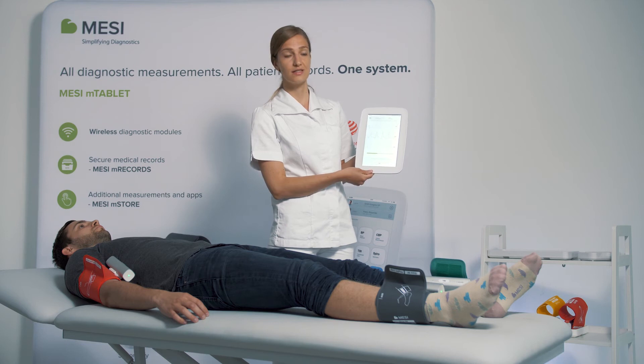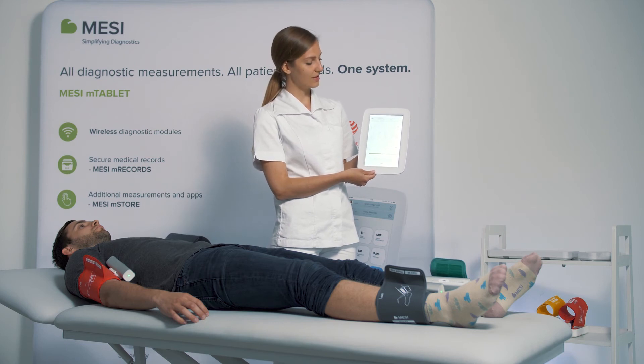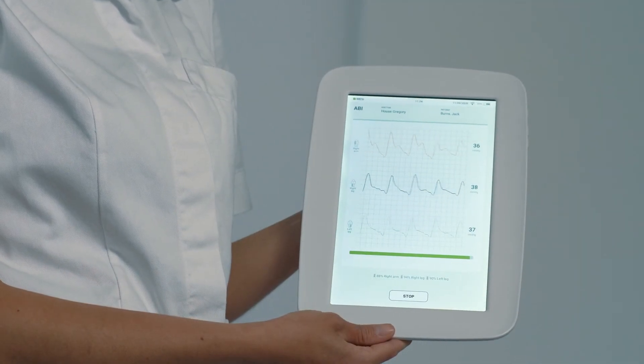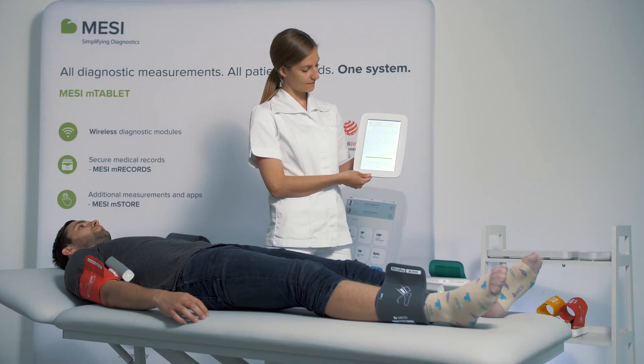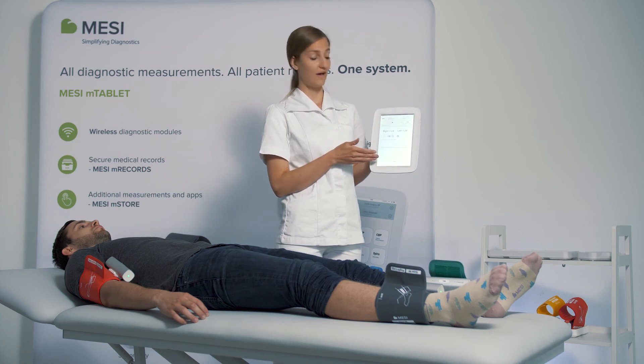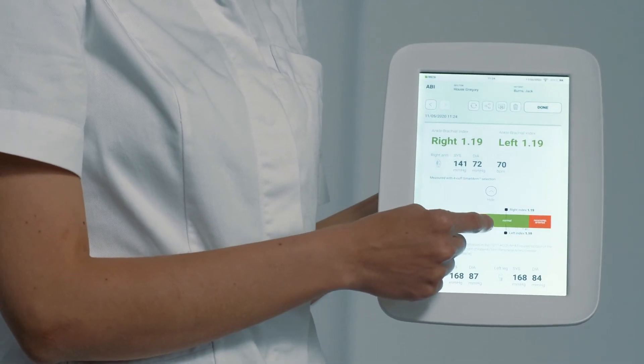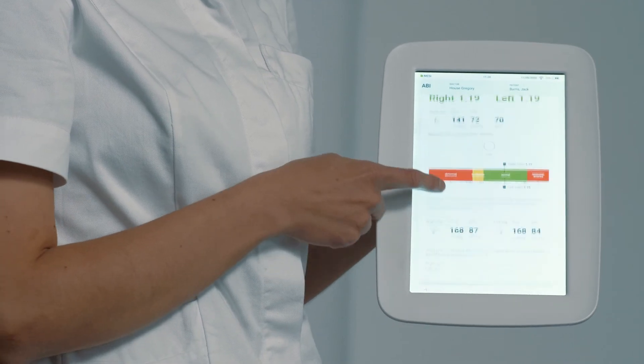After a couple of seconds, the measurement will be concluded and we will receive the result immediately. Here we have the left and the right ABI, and the result is automatically put onto the PAD reference scale.